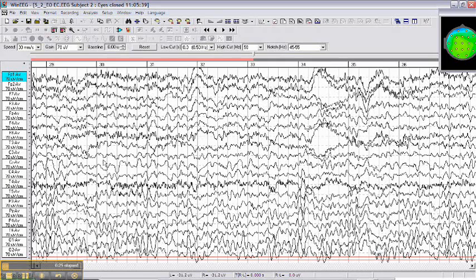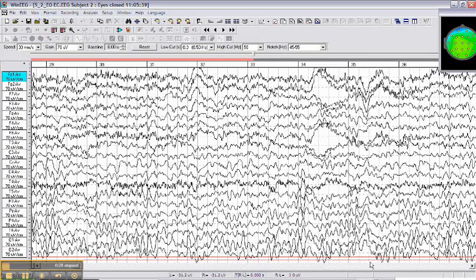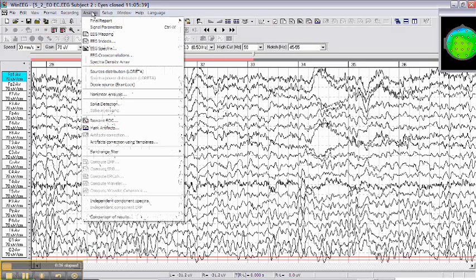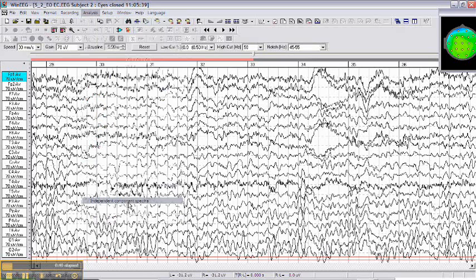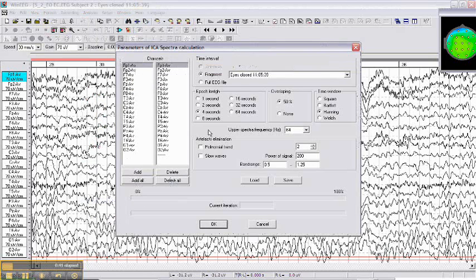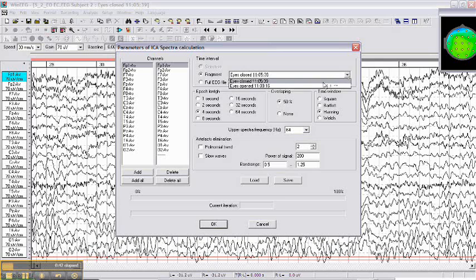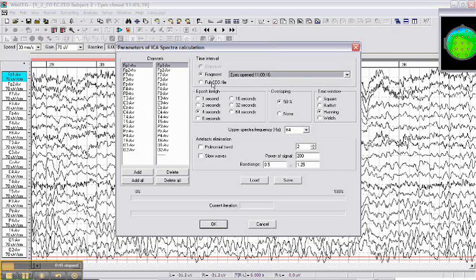We have this file. We can select the time window or we can simply go to analysis and compute independent component spectra on eyes open condition. We simply select eyes open condition. You have all channels listed here.